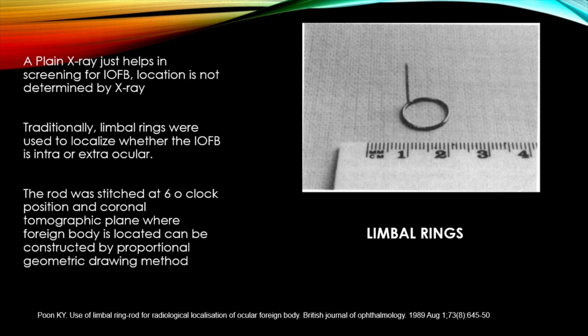Plus, there is a magnification factor of 1.1, which you use to draw a circle for a normal size globe. Then you know whether it's inside the globe or outside. This is all approximate. But basically, that is the theory behind the limbal ring. But what is more useful and done is called Sweet's method. I don't know whether you read it. Sweet's method is not a joke, it's given in many other books too.